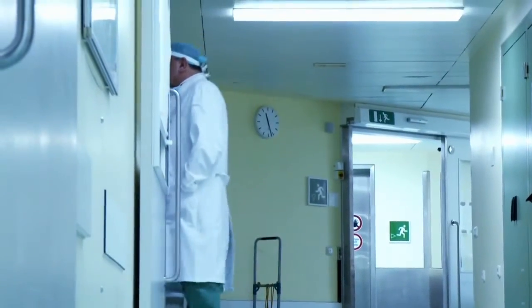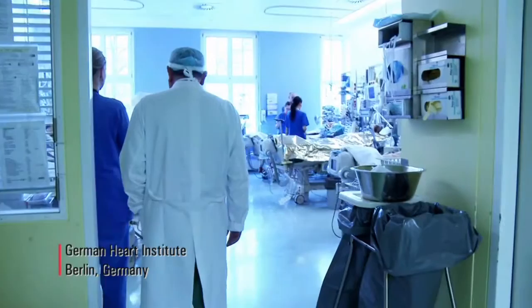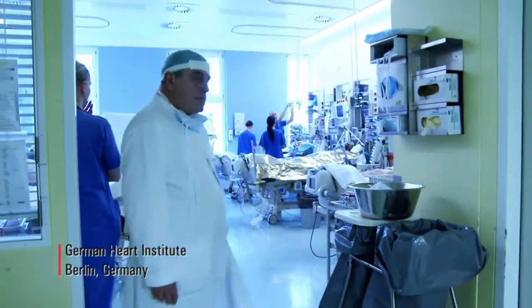In the past, a magnification of 2.5 or 3.5 was sufficient. Nowadays, however, we have to go to smaller structures. We nowadays operate on very small babies, premature babies. The smallest we have operated here had only a weight of 900 grams. And of course then you have to deal with very small structures. A well-experienced surgeon is above 40 years old. That means he can never have a good eye.